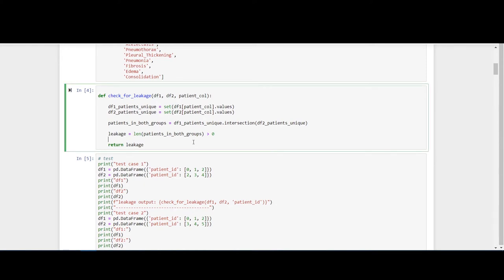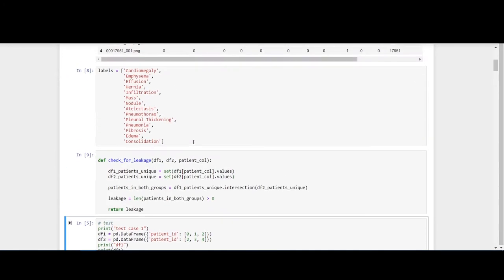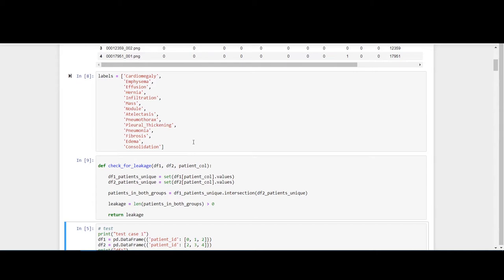And what does leakage mean? So what does this function do? Okay, for example, consider you had pneumonia some time back and you went to the hospital to take your chest X-ray, and the doctors say that you had pneumonia and you need to take medication. So you take the medication, and then a week afterwards you go again to the same hospital for an X-ray, so that you know whether your pneumonia is recovering or not. Okay, so if the pneumonia is not recovering, the hospital has two X-ray images of yours, and they listed them as X-rays of pneumonia. And by chance one X-ray goes into the train data set and one X-ray goes into the test data set. So this is a huge problem.